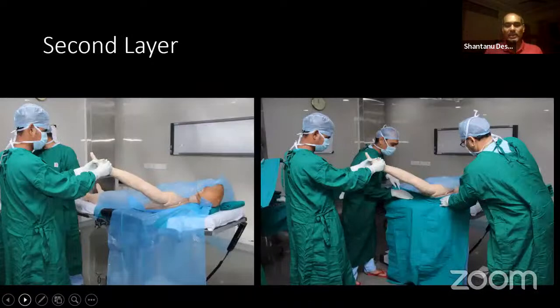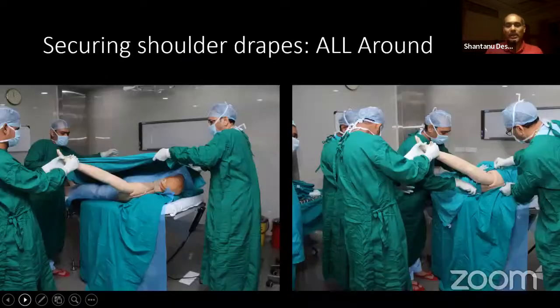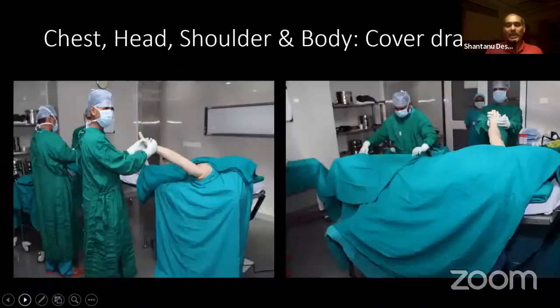So for supine position, we have to really make sure that our drape goes under the scapular blade. Many times we put some support under the scapula, either a rolled sheet or hard material or a water bottle, so that the shoulder comes up. That gives a few inches of space from the table, and this helps you make sure your drape goes under the body up to the scapular edge, so that there is no contamination happening from that side.